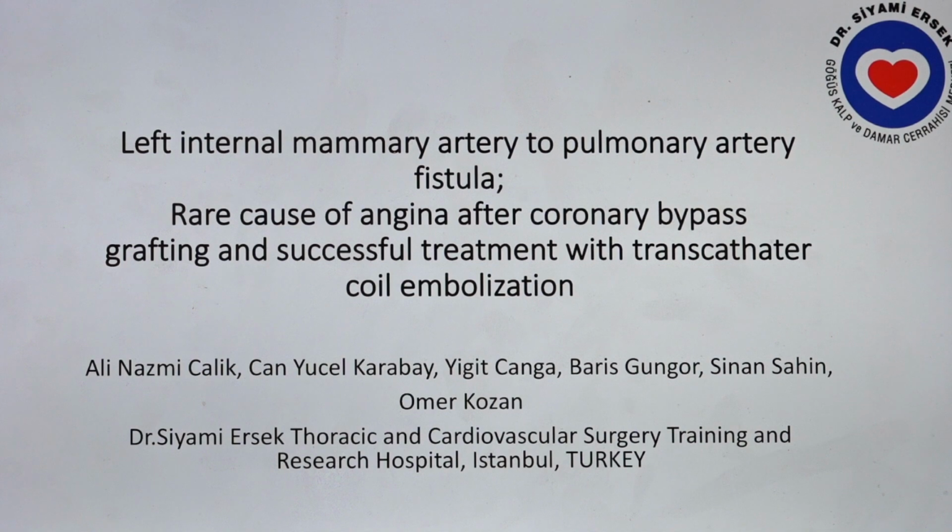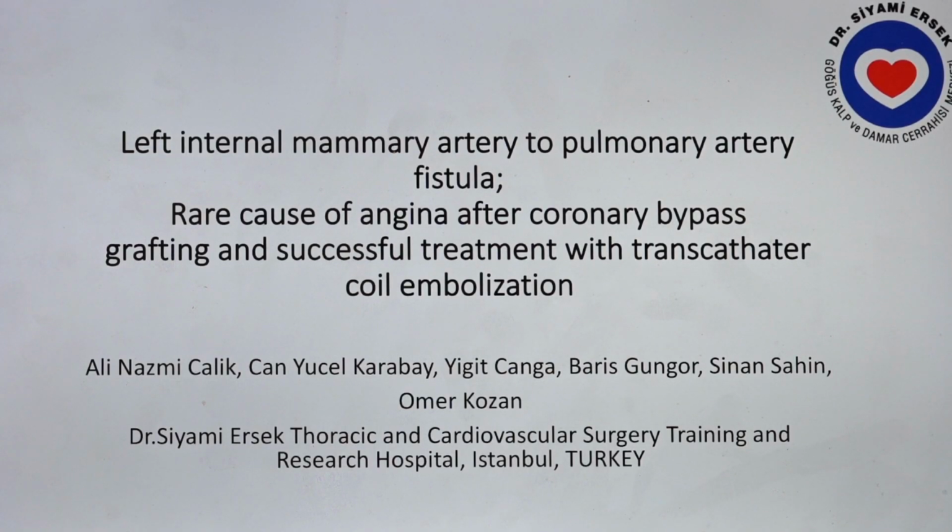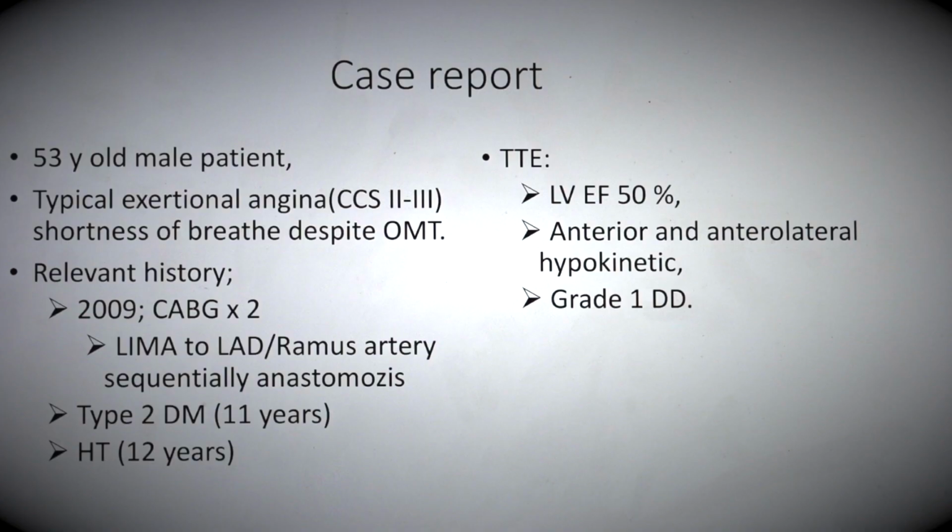I would like to present a case about a left internal mammary artery to pulmonary artery fistula formation and its successful treatment with transcatheter coil embolization. My case is a 53-year-old man who was admitted to our outpatient clinic with typical exertional angina and shortness of breath.